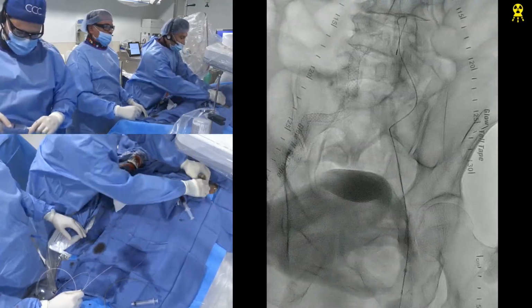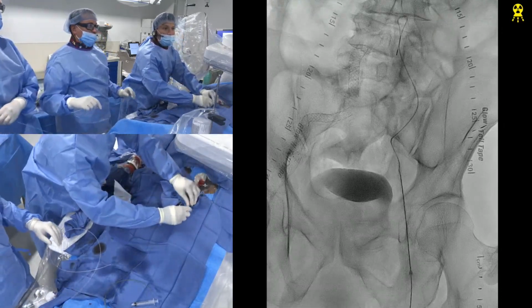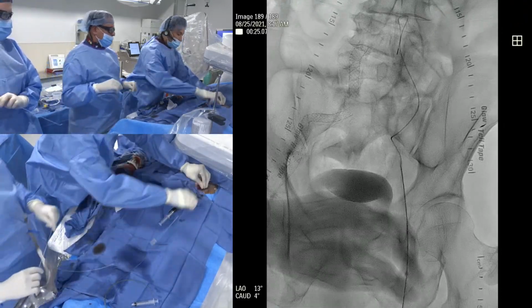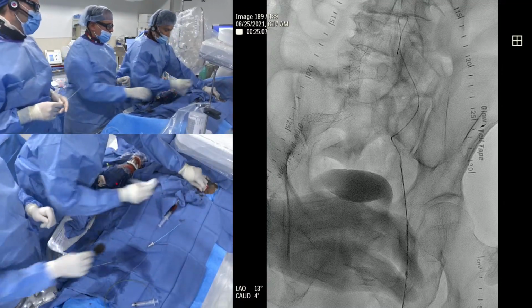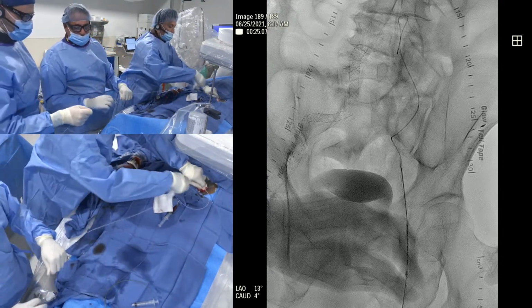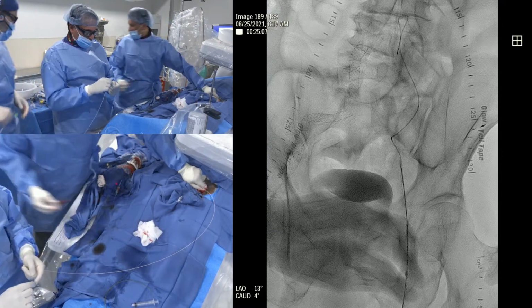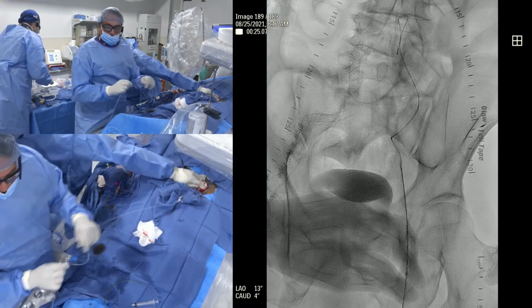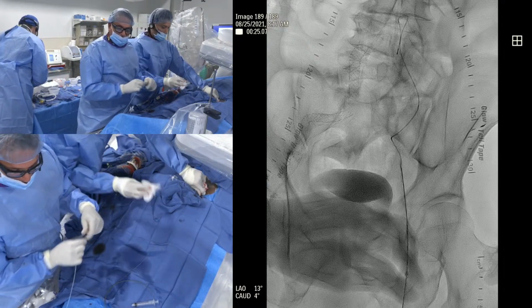No? I got it. You got it in. Okay, good. All right, so now we're just going to go and get this wire up into the aorta. The key now is we're going to have to image. So what we're going to plan on doing is change out for a 7 French sheath, and then change out for an 014 Spartacore, and then run an IVUS through to understand the morphology of the plaque and whether the plaque involves the aorta or not.